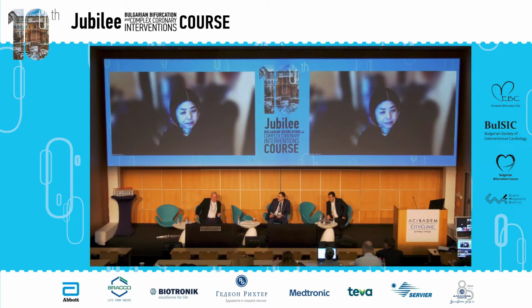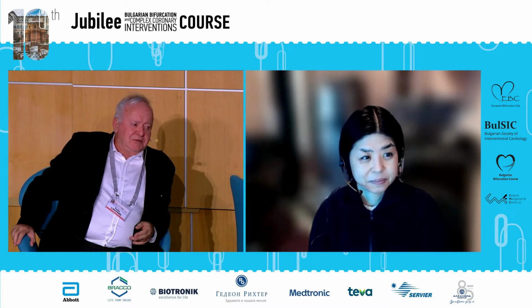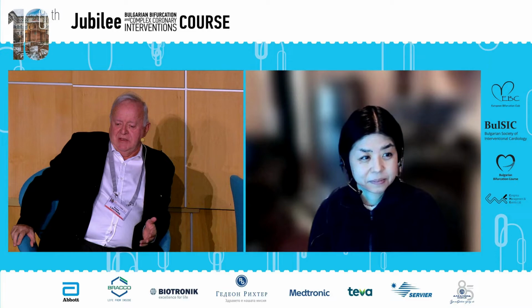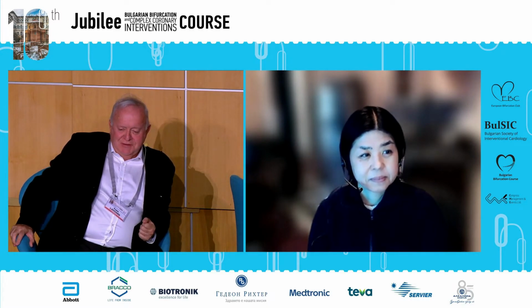So in France, this will be FFR because this is reimbursed, and IVUS is not reimbursed. That's an issue. But I'm fascinated by the data you show, even if we are not able to have them in our own patients frequently. Of course, we do IVUS when we don't understand the situation, but in the majority of cases, we try to do without.